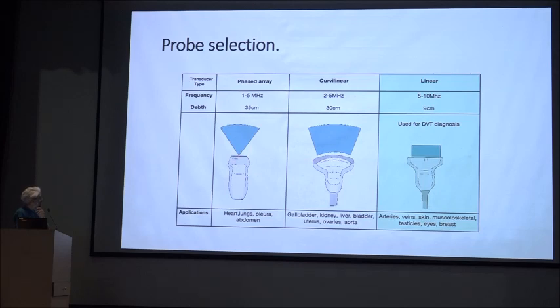It is basically the piezoelectric crystals. They are centered and packed in the center of the probe in the case of the cardiac probe, which makes it very useful to place between the ribs and use for a cardiac examination. The curvilinear probe also can be used, but the resolution and the penetration won't be as good as compared to the phased array probe.